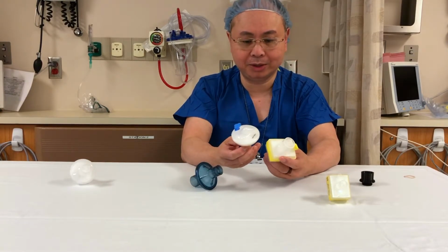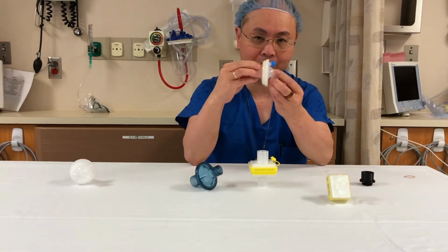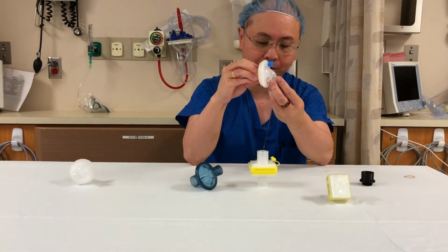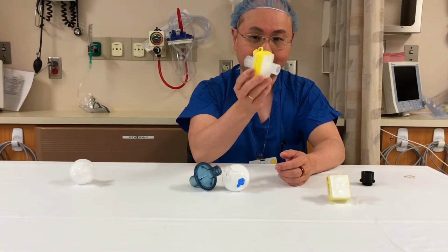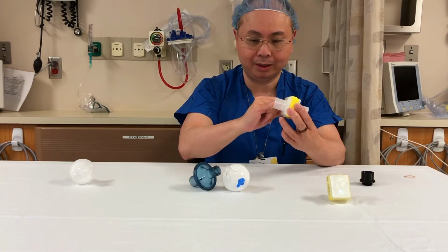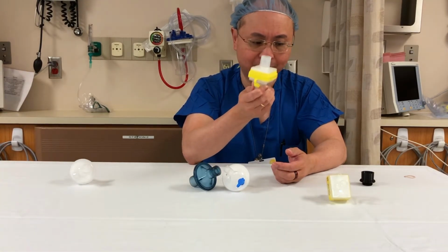Now, viral filters can be different shapes. Some of them are designed so that one end will go onto the circuit and the other end will only go onto an endotracheal tube. On the other hand, this type of filter has both male and female 22 millimeter adapter ends, and is also able to attach to an endotracheal tube. The physical shape varies from filter to filter.